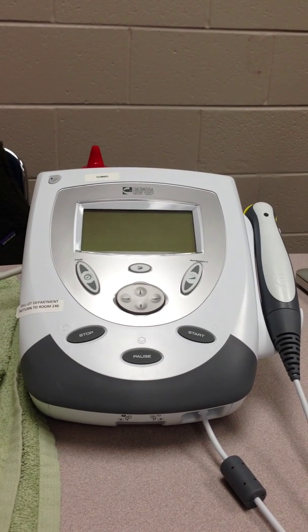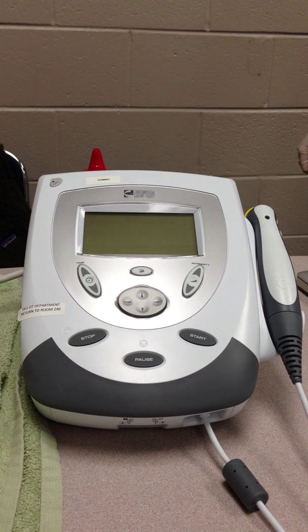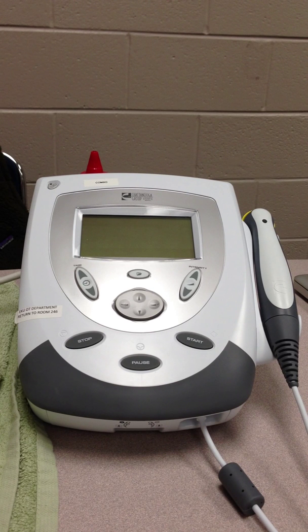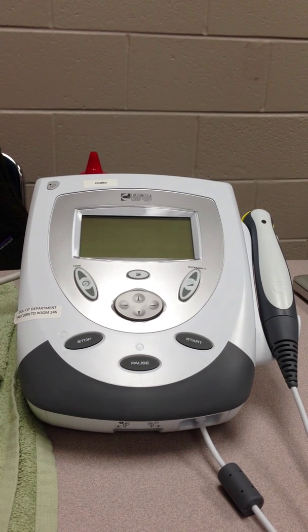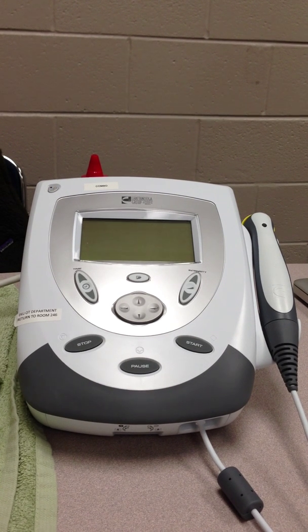Establish appropriate dosage based on the goal of intervention. Set intensity and quickly apply the transducer to the skin. At the end of treatment, turn off the power, clean and dry the patient, and clean the transducer. Perform all appropriate post-treatment evaluations.